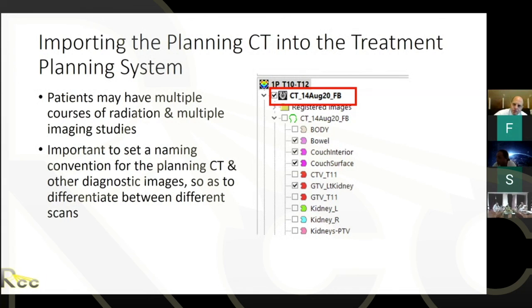It's very good. Someone said he has a question, right? Yeah. Welcome back. I'm sorry? Can we define isocenter in any point? Is there any effect? Can you define the isocenter at any point of your choice, or is there a preference? Is that your question? Yeah, a little bit.